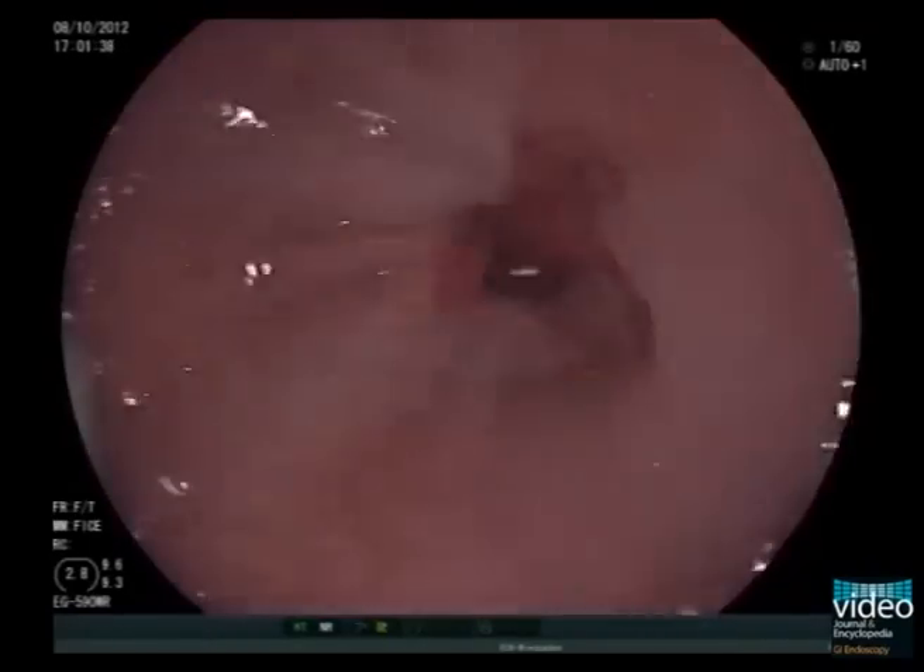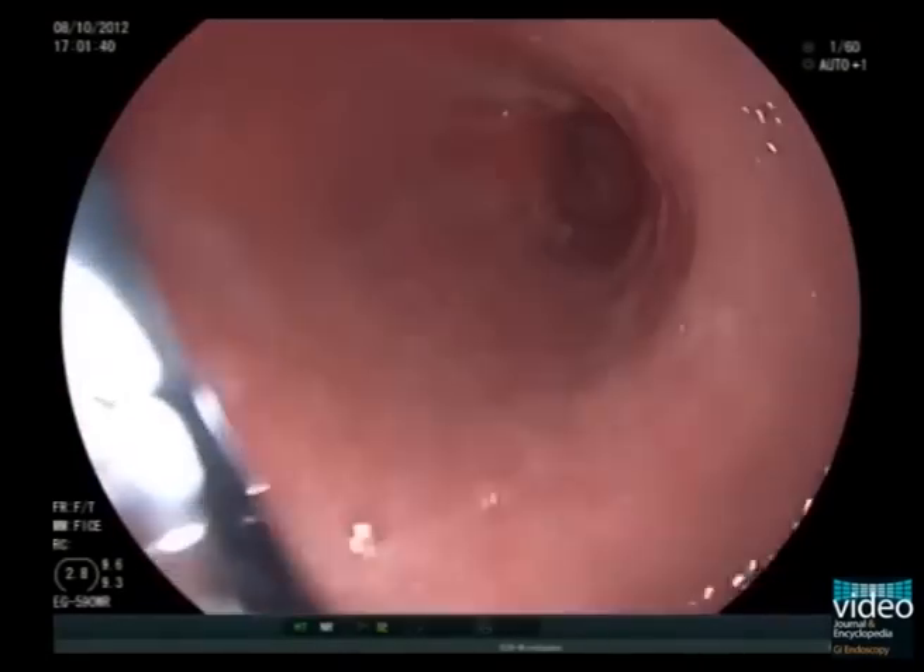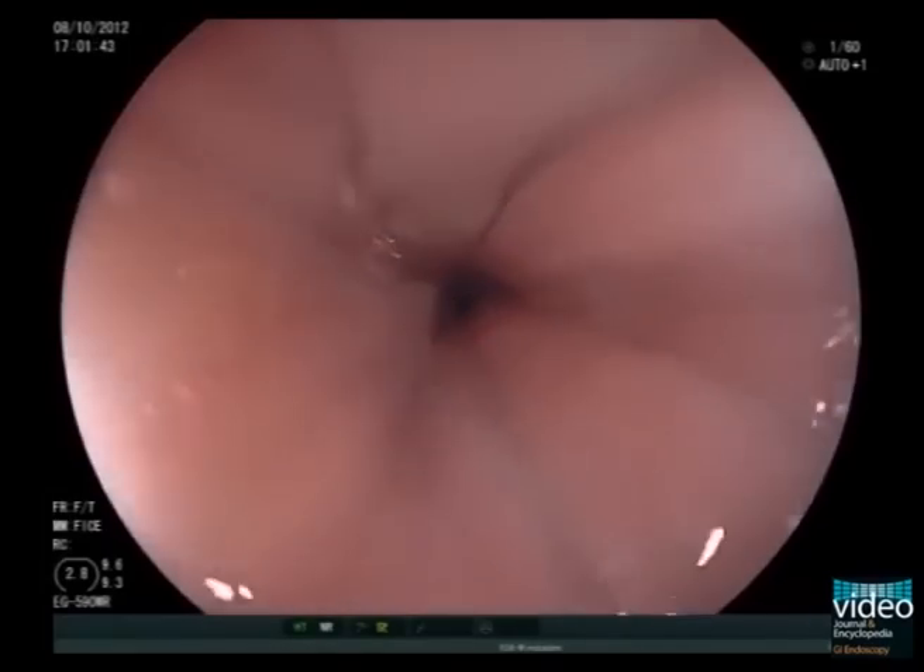Back in the esophagus, we recommend withdrawing the endoscope slowly to allow, once more, careful inspection on the way out.